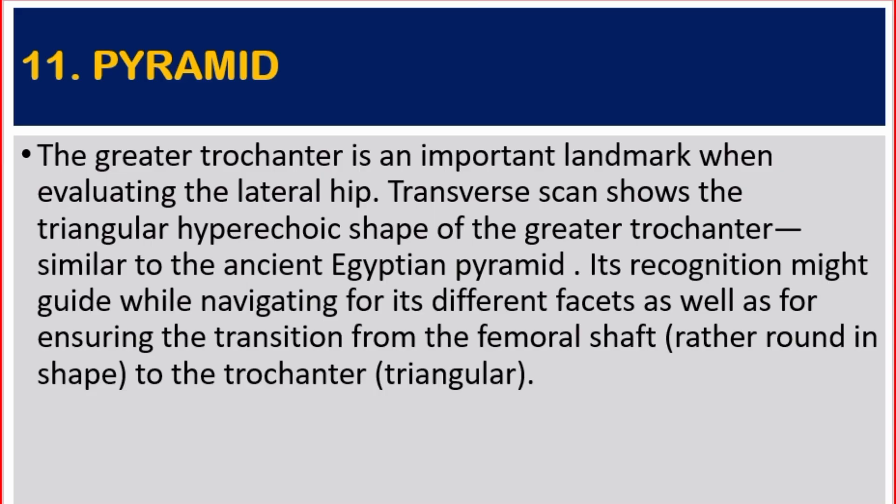Number eleven: pyramid. The greater trochanter is an important landmark when evaluating the lateral hip. Transverse scan shows the triangular hyperechoic shape of the greater trochanter, similar to an ancient Egyptian pyramid. Its recognition might guide navigation to its different facets, as well as ensuring the transition from the femoral shaft — rather round in shape — to the trochanter's triangular shape.